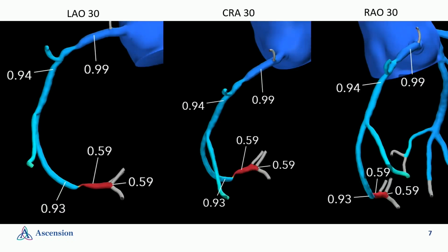So looking at the patient's HeartFlow, looking in several different projections, compared to the other projections that we may have seen, there's a definite lesion in the distal vessel, and there's a definite drop in pressure across that, a significant translesional gradient. That proximal lesion, which was 50 to 60%, is not physiologically significant with only a 0.05 drop. Had I not had this information at the lesion-specific level, I might need to test that invasively with a physiology wire, making the procedure potentially more complex or more costly, putting on the administrator hat. Or some people would just stent it, and then the patient might get an unnecessary stent in the future, causing issues.